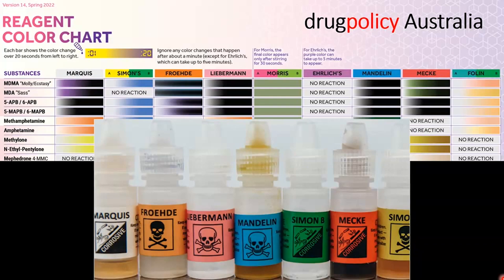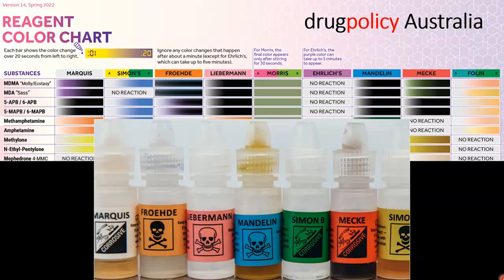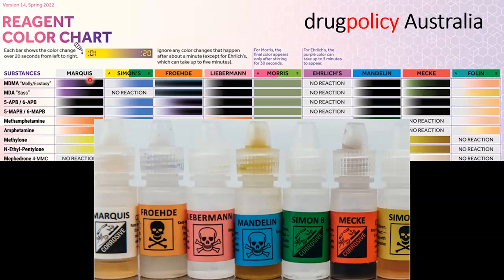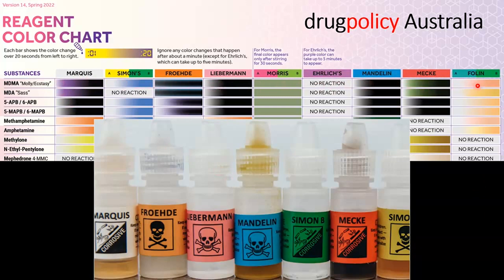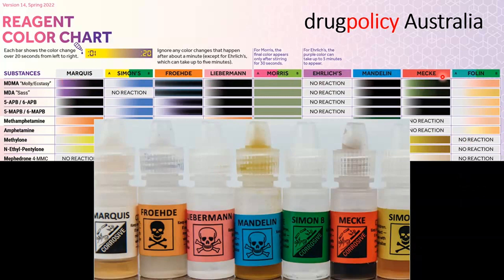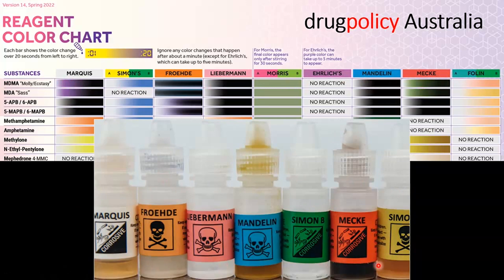Before we move on to how Marquee works, I just thought I'd go through some of the features of the reagent colour chart, because it's really one of the best ones I've come across, and I'm in the process of changing my teaching to incorporate it. On this slide, I'm showing you the full suite of tests the chart covers — really all the common presumptive tests that are available. The name of each presumptive test is given a colour code, which corresponds to the test solutions provided in the kit.